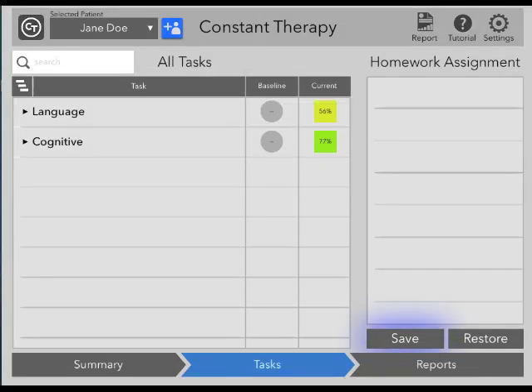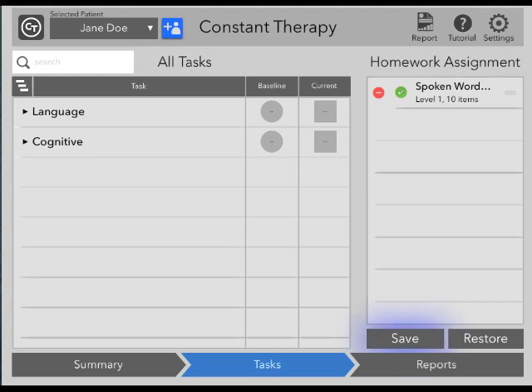Hello, and thank you for choosing Constant Therapy. Once you have selected a specific patient, there are three screens available to you.